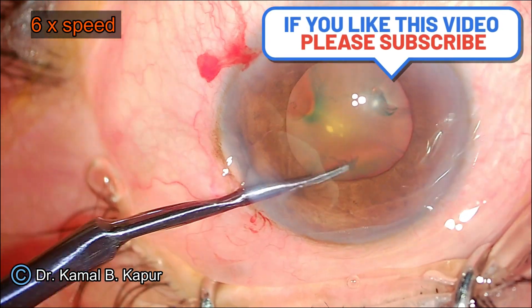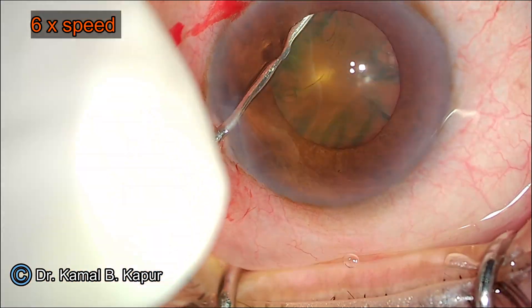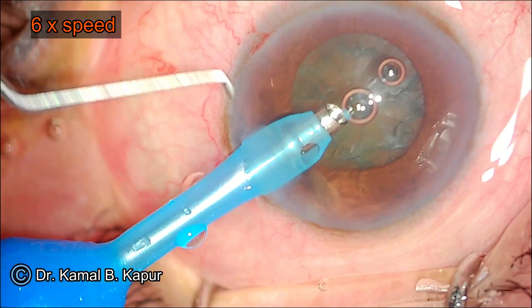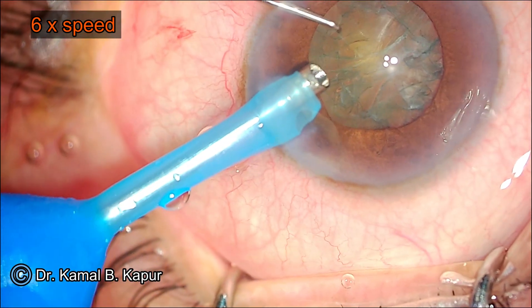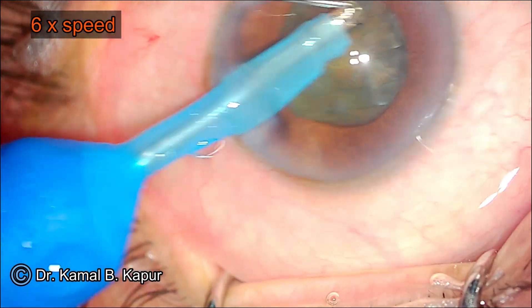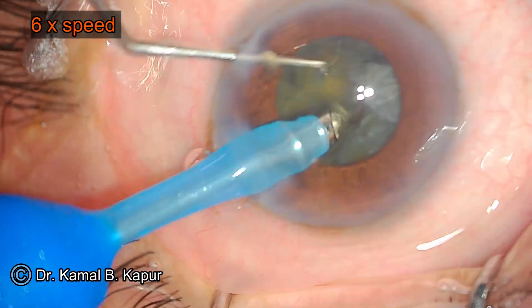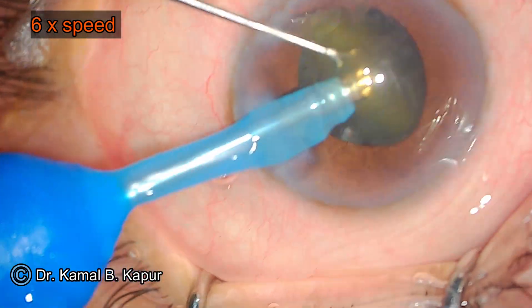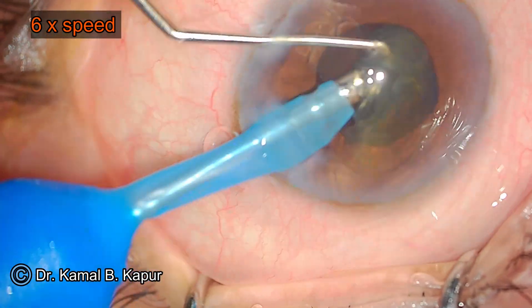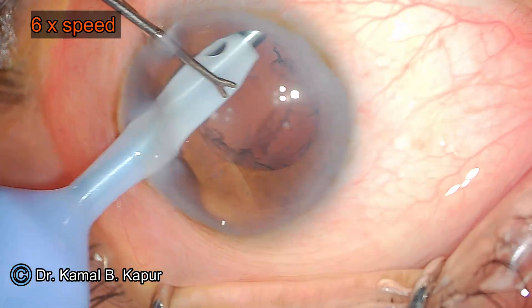Usually, the procedure starts with removal of the cataract, because cataract removal will help give a deeper anterior chamber. While making incisions for the cataract, we have to be sure that we don't make very limbal incisions, because any amount of oozing blood can cause impairment of vision. Also, ensuring good corneal clarity is essential, as any corneal haze will impede visualization of the trabecular meshwork.